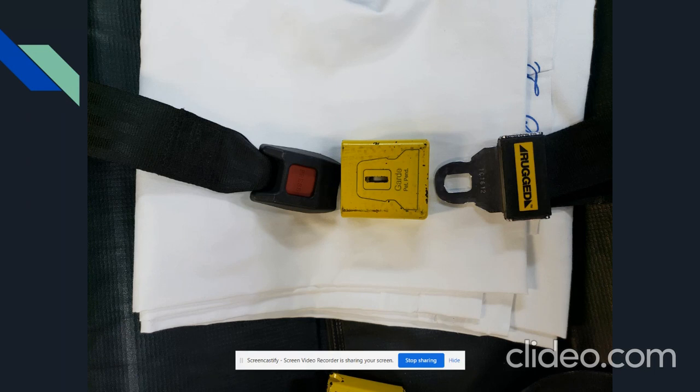The patient is unable to pull it apart. They're unable to get to the release button. If you notice the slit in the middle of the guard, that is where you can either put your scissors or another device to press down on the red unlocking mechanism and unlock that, and it'll come right off. So it's very quick to place. It's very quick to take off.